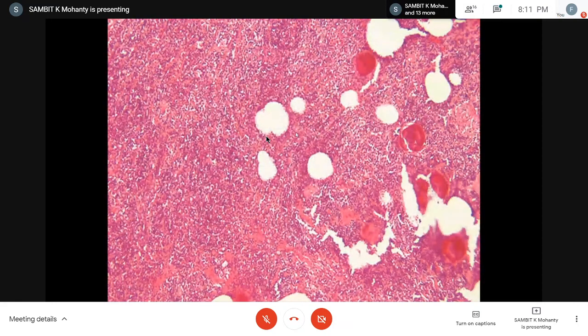So who can help me with the intraop? Any residents or fellows in the group? I mean senior residents and residents. This is the intraop frozen section, right?